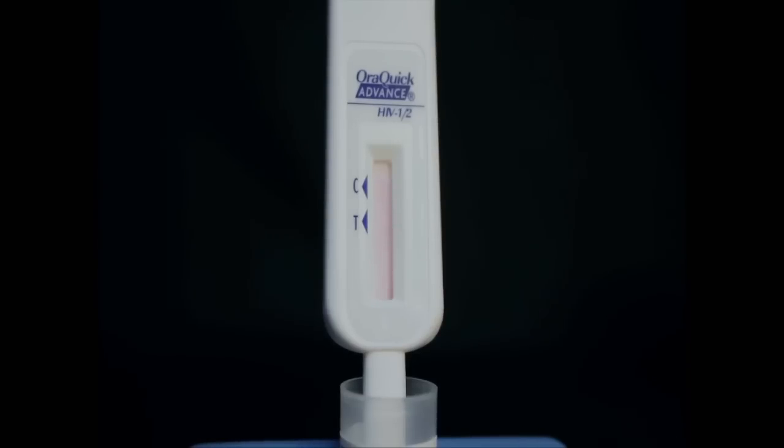The pink fluid will gradually disappear as the test develops. Read the results after 20 minutes, but not more than 40 minutes.